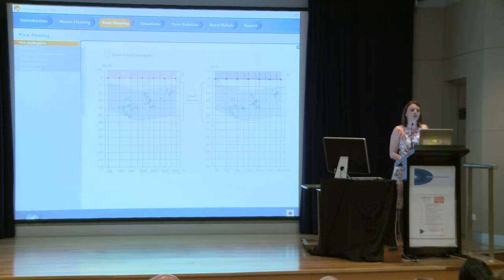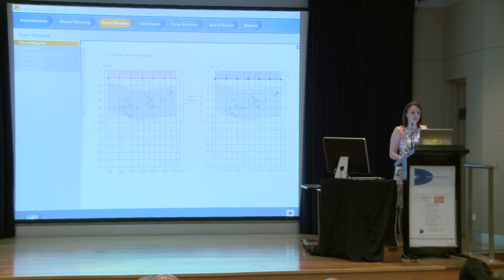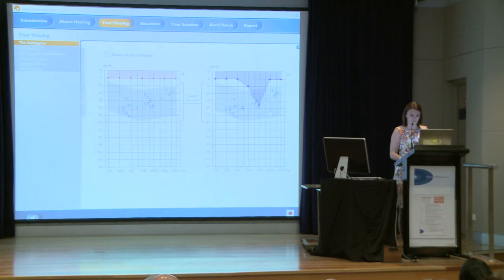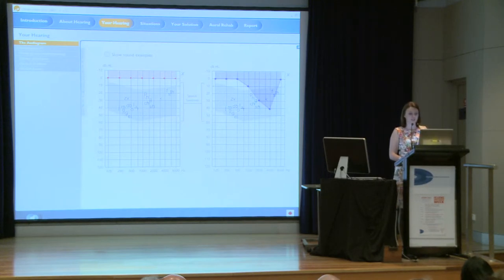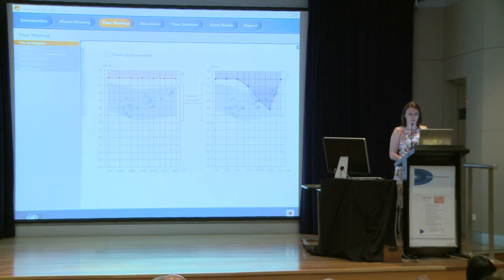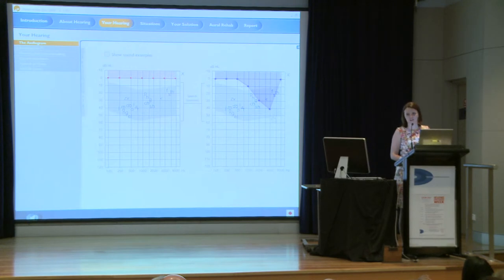When you have noise exposure, long-term it eventually looks very similar to presbycusis. But at the start we often see hearing well within normal limits. Looking at the left ear here, hearing is well within normal limits in the low-pitched tones, and you can see it recovers in the very high-pitched tones. But there's a notch especially around 4,000 Hz, which is a result of noise exposure. This is when we first start to see the damage as a result of noise.